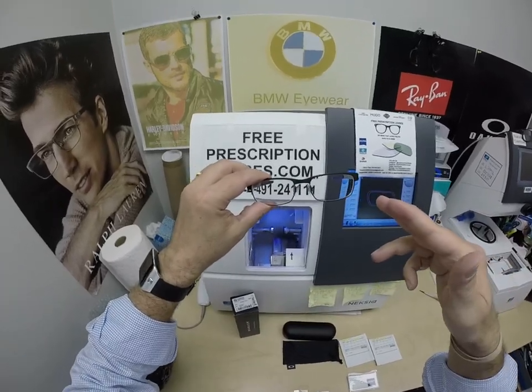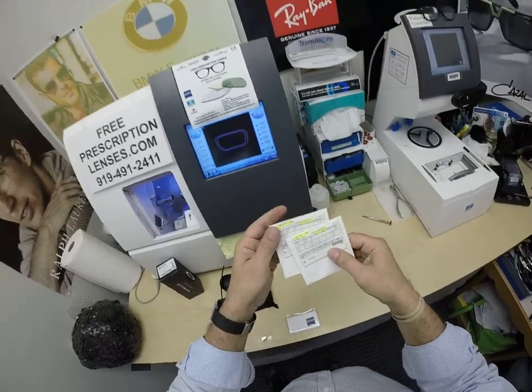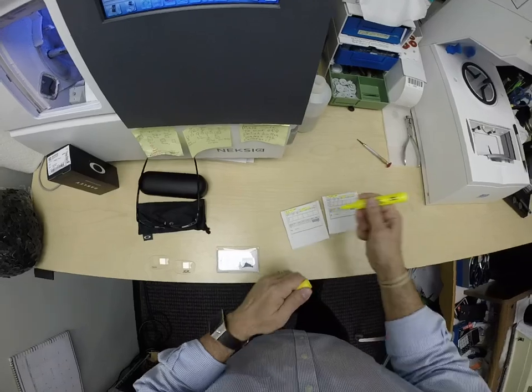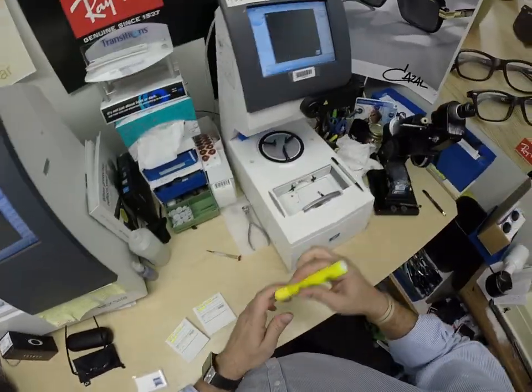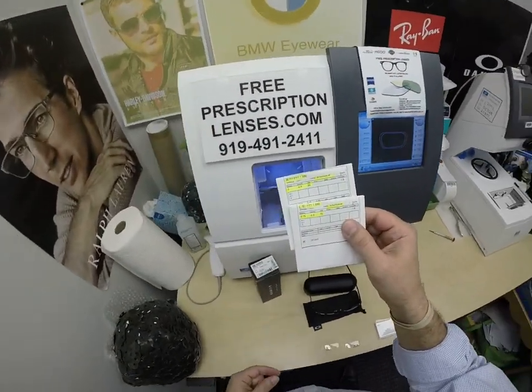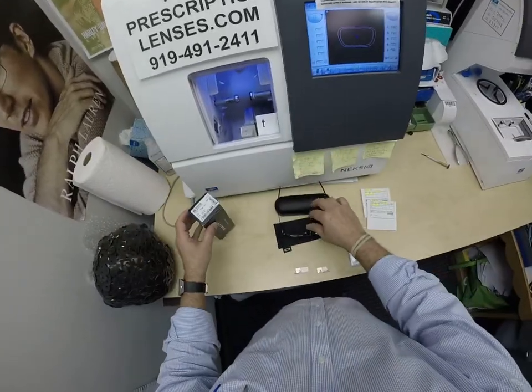He got the Zeiss Photofusion Extra Gray with DuraVision Platinum Anti-Glare Coating. I've highlighted the prescription for the right eye — let me highlight that. I'm trying to get everything shipped second day air so you'll have these Saturday for Easter.